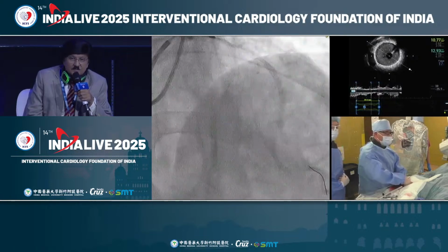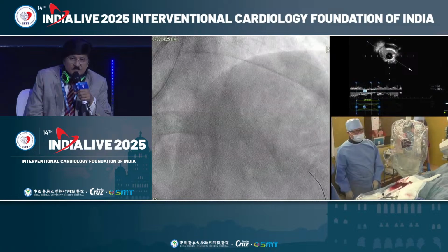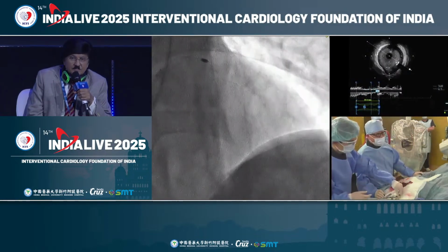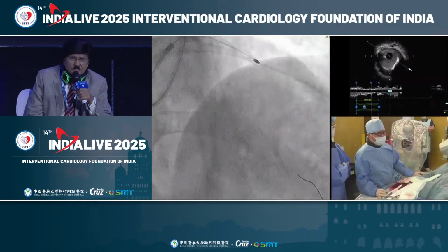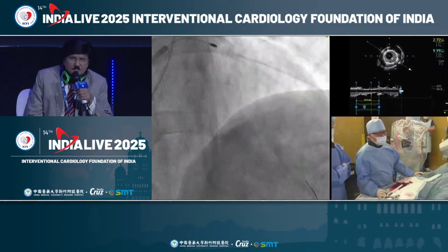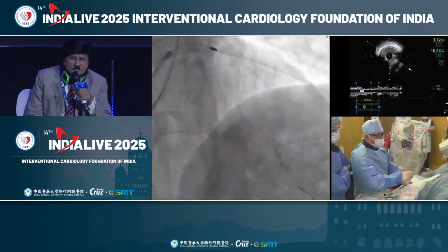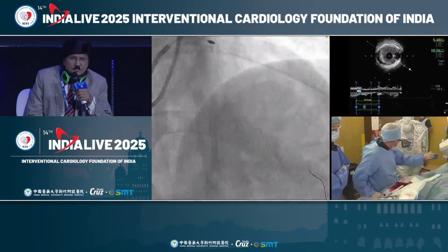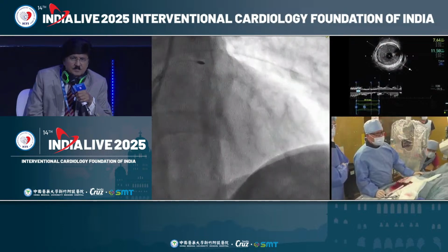Now I make 1.75 rotation with 180,000. This calcification is very hard. Now I'm still rotating it. This part is very hard. You understand? The sound is much different. Okay, but already passed through that. Okay, next, please take a deep breath and stop.